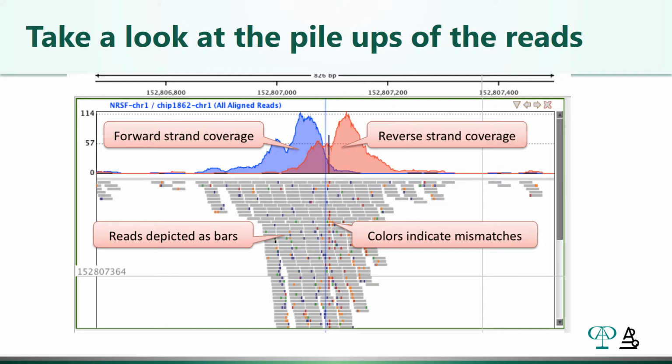And when you look at these pileups of the reads, what you get a good sense of is the depth of coverage, the uniformity of coverage, and you also get to look at the mismatches against the reference sequence and try to assess whether or not you think they are real. And clues about whether they are real or not would be, for instance, if you saw a variant, a mismatch, but it only occurred in one particular amplicon and not in other amplicons that overlap the same region, or if you saw a variant that only occurred in amplicons reading in one direction, so that's the strand bias that I mentioned, those are all clues that perhaps you are looking at something that is an artifact of sequencing.